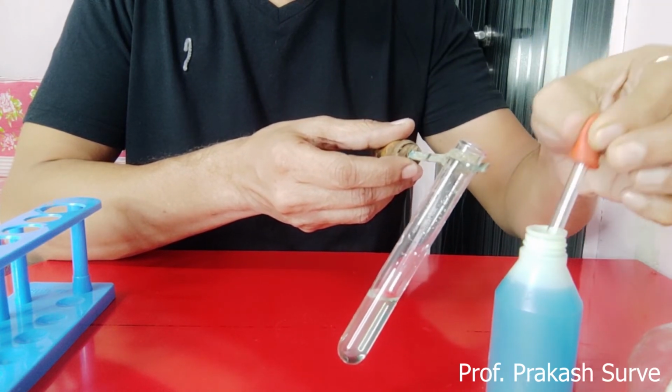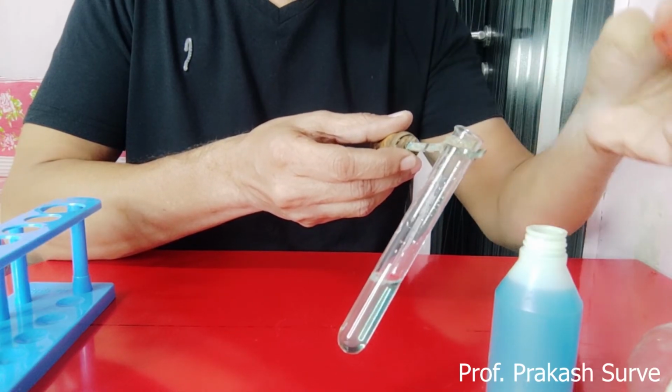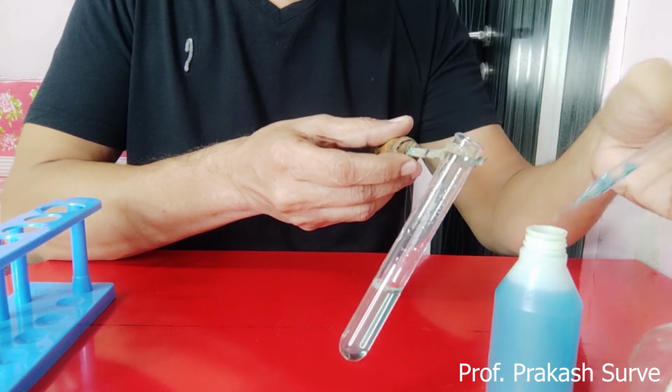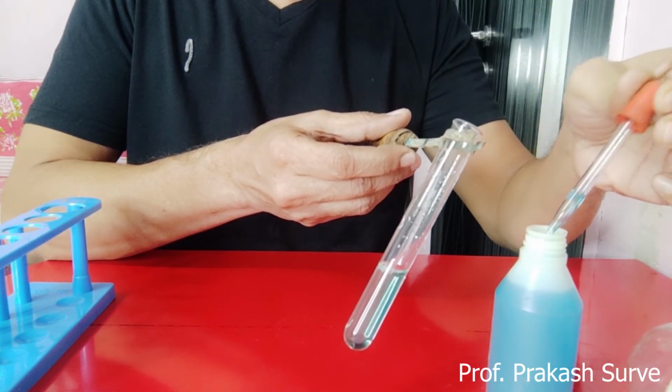So 1 ml of Benedict reagent, and then we have to boil this over a spirit lamp.